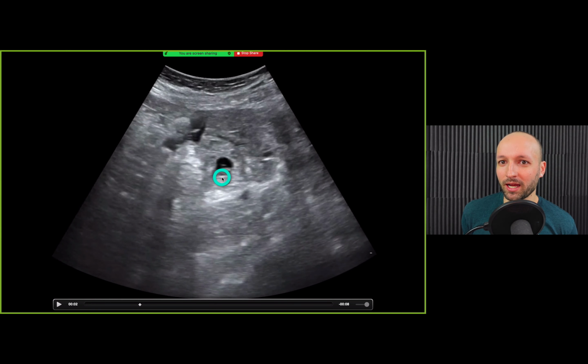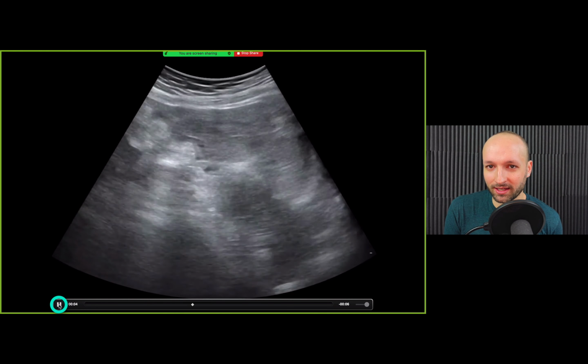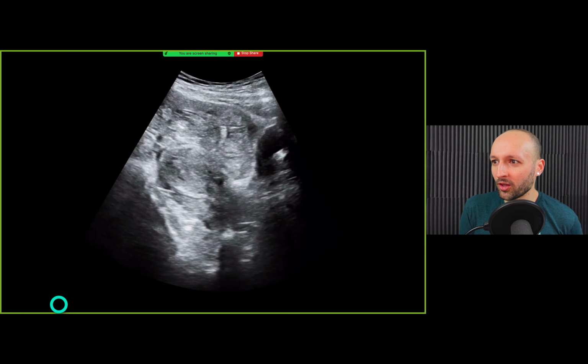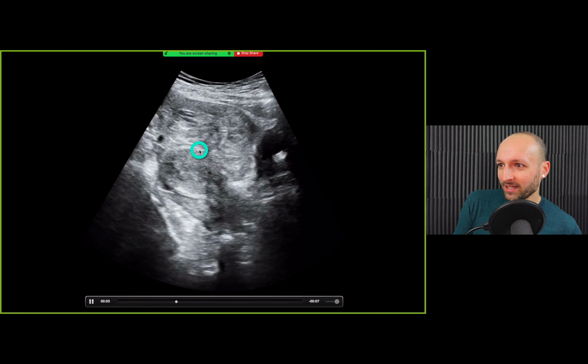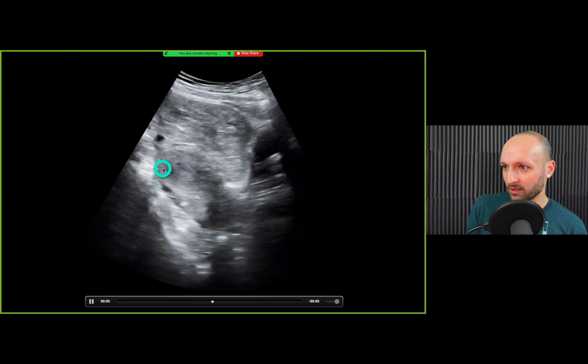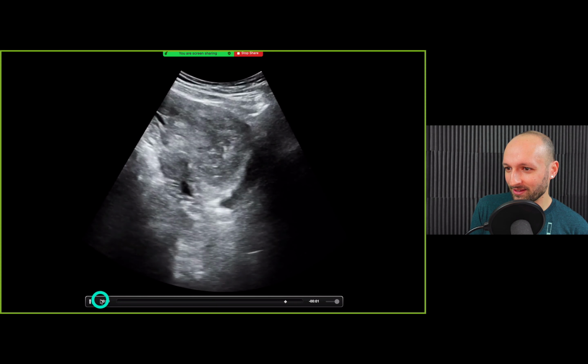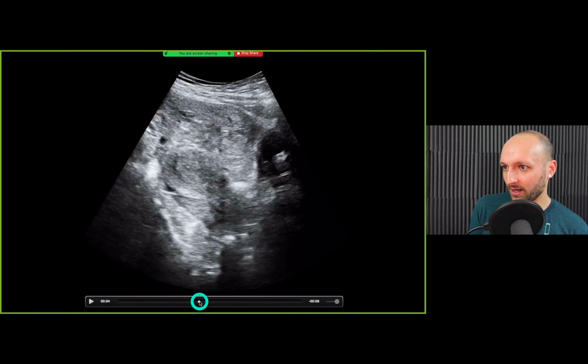Yes, exactly right. Now, this was the first one. This is actually one that I saw. Another physician was like, hey, I think this is a gestational sac, but can you help me out with it? I went and got another image, and here is the uterus, you guys. It's right here, going into the vaginal stripe. Do you guys see that gestational sac in the uterus? I sure don't. What do you guys think all of this is up here?